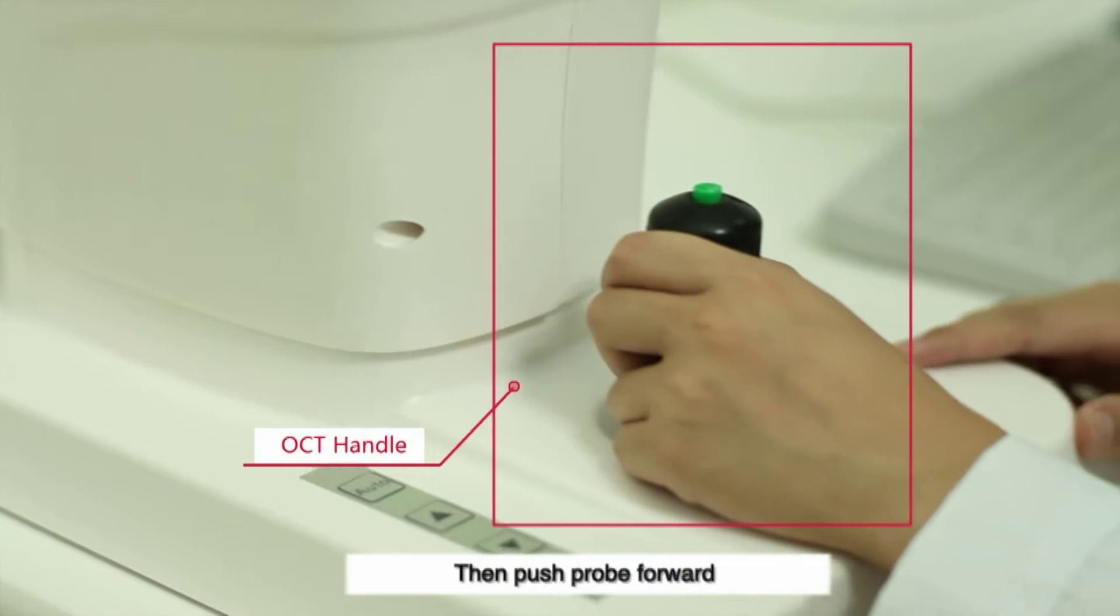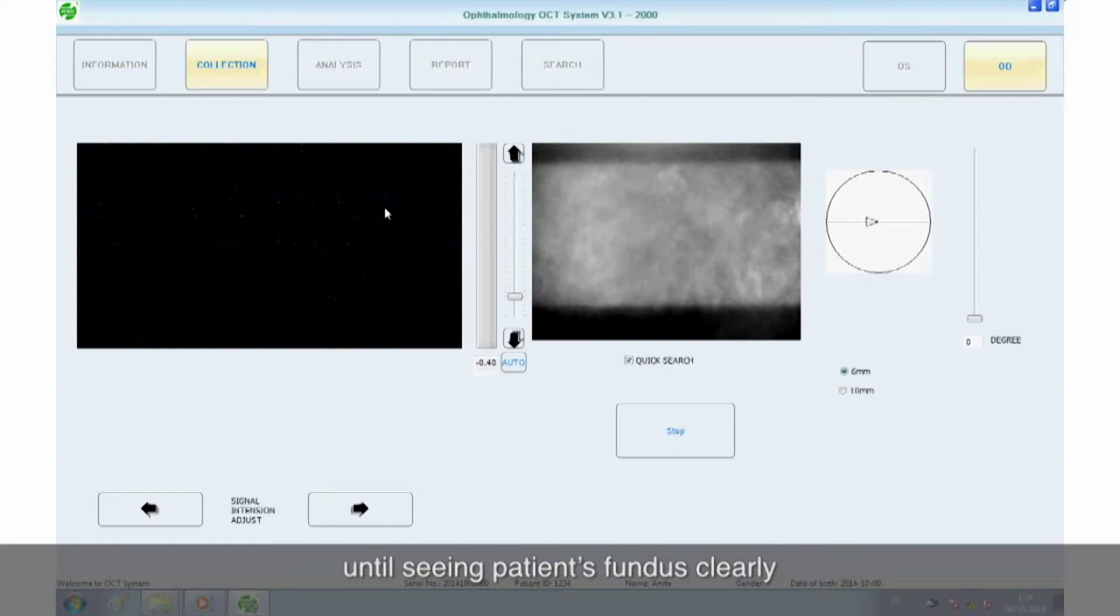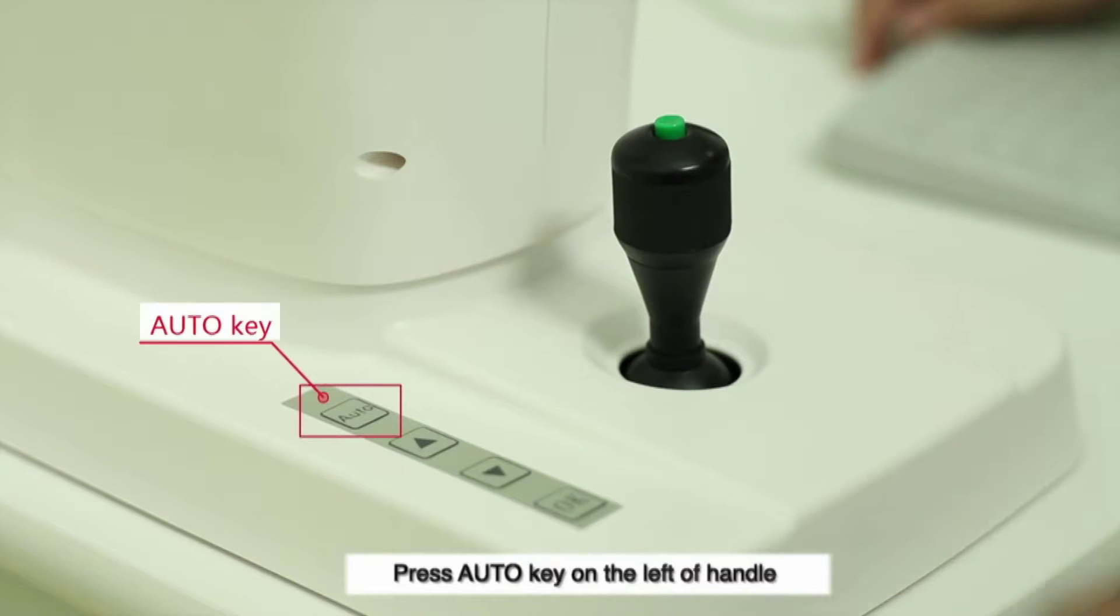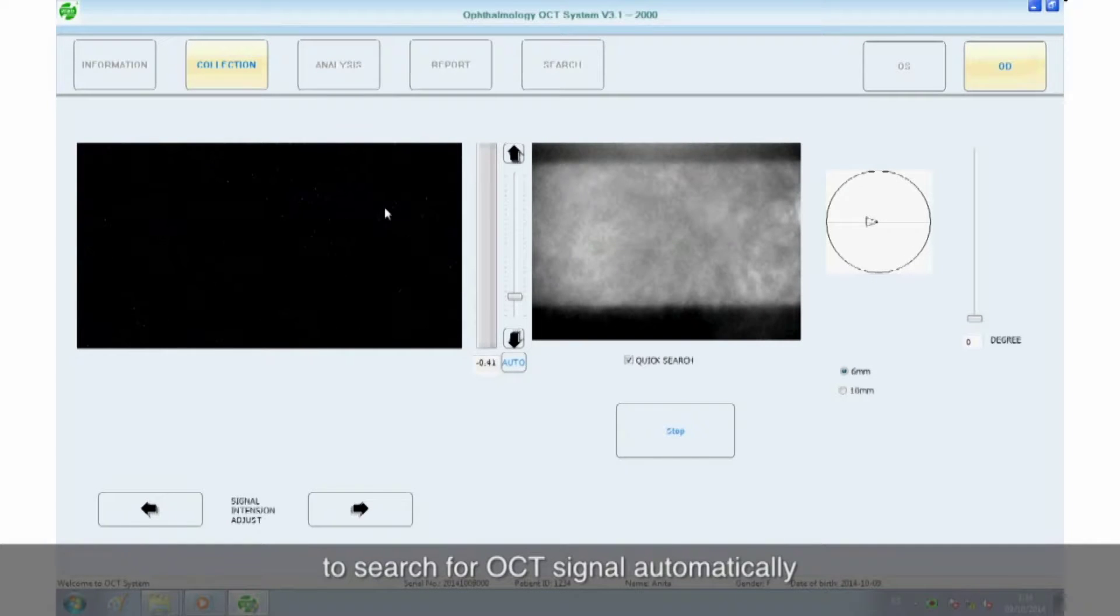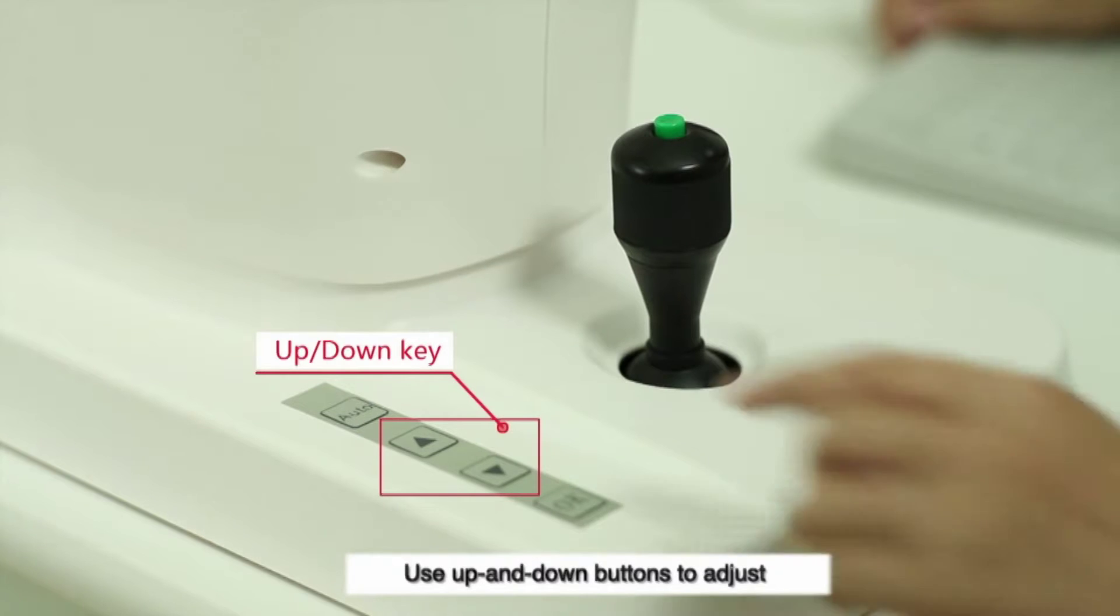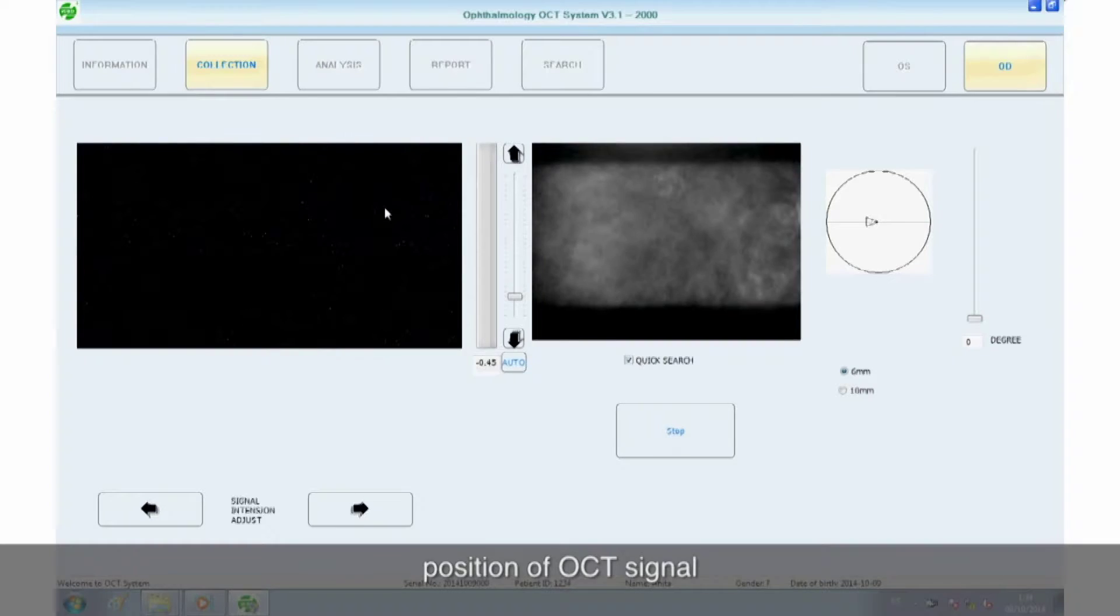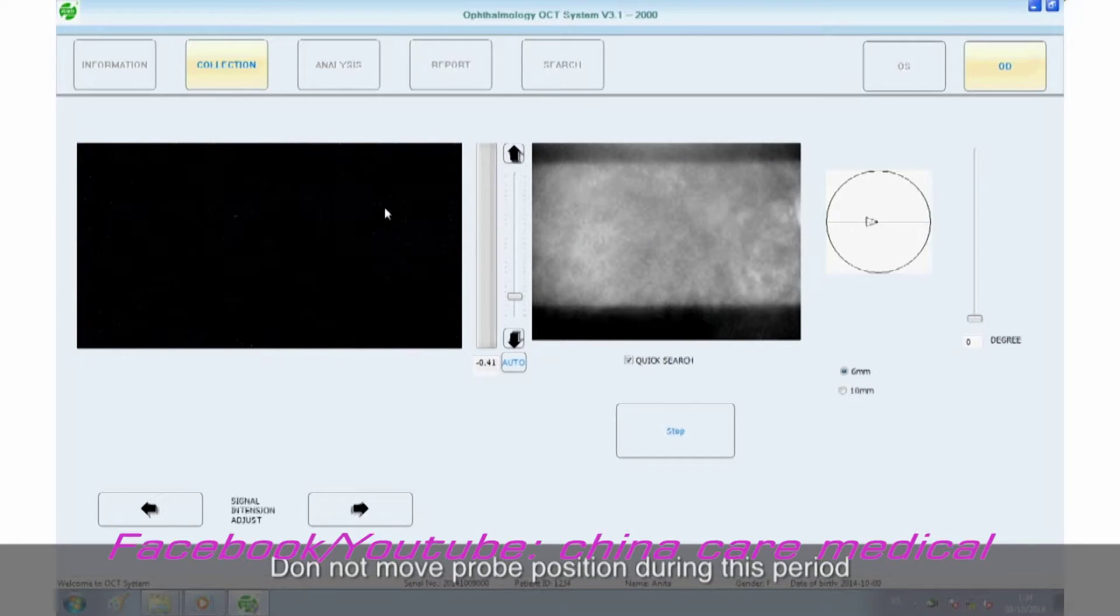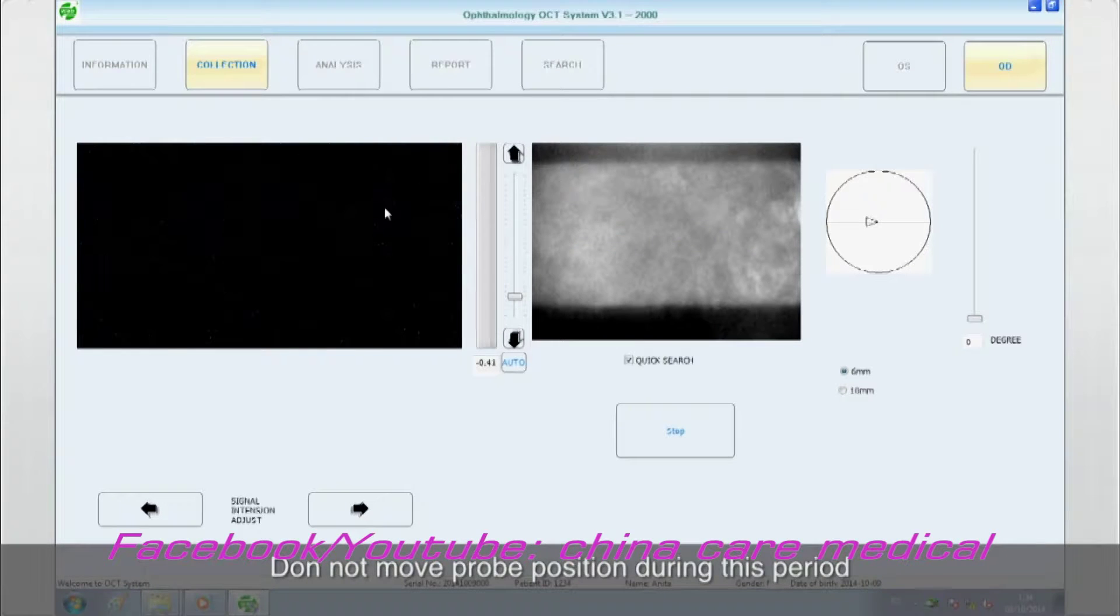Then push probe forward until seeing patient's fundus clearly. Step 2: Press Auto-key on the left of handle to search for OCT signal automatically. Use up and down buttons to adjust position of OCT signal. Do not move probe position during this period.